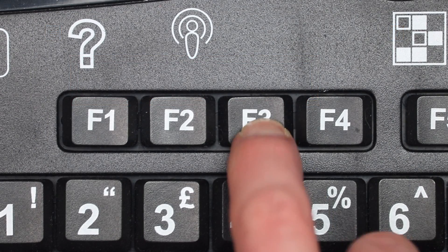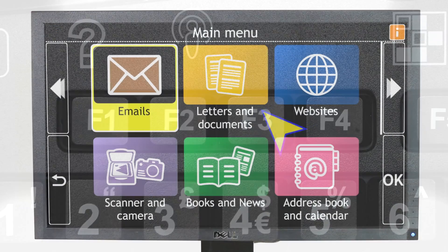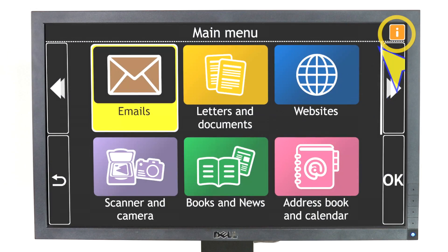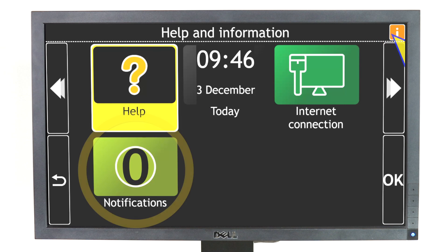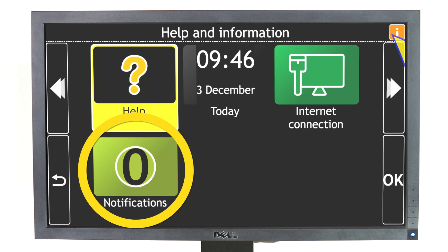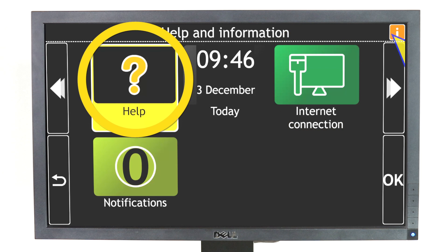Alternatively, press F3 on your keyboard or click on the yellow button at the top right of the screen. Here, you can find help and information about your device, such as notifications, whether you're connected to the internet, and more.